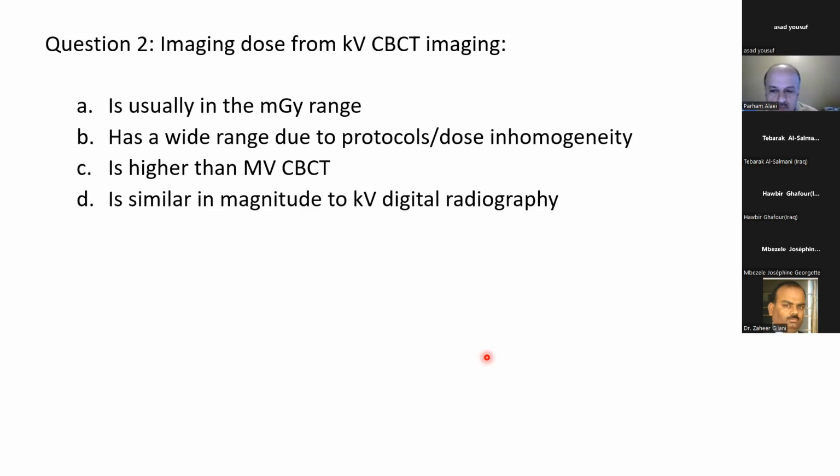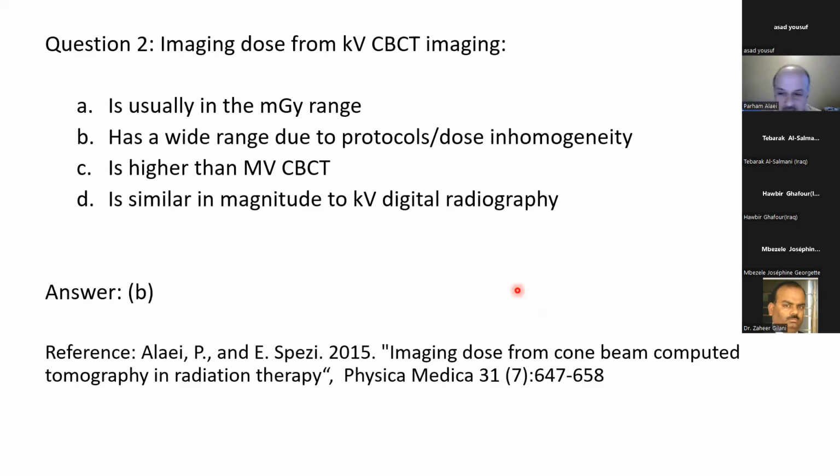Okay. 36% gives the first option, 18% gives the second one, 9% gives the third one, and the last one is also 36%. So there is no consensus on this one. It may have been a bit of a vague question, I guess. So the answer is actually B. It is not in milligray. I mean, again, it's a vague answer. I guess it could be milligray for head and neck.